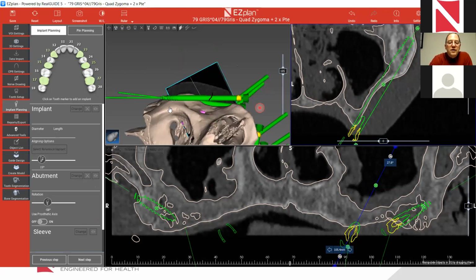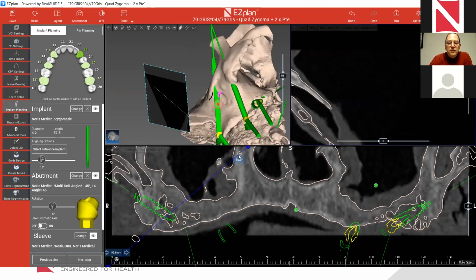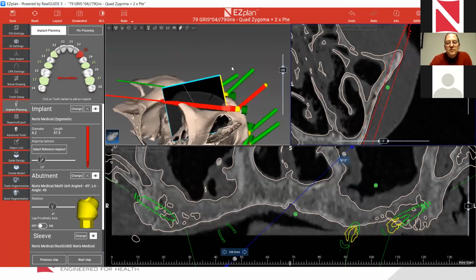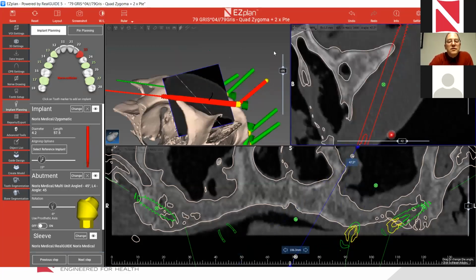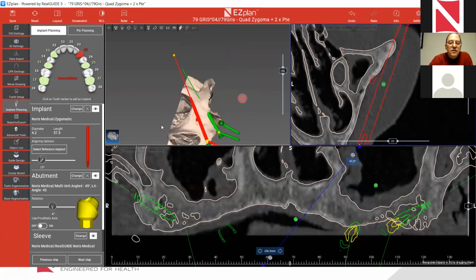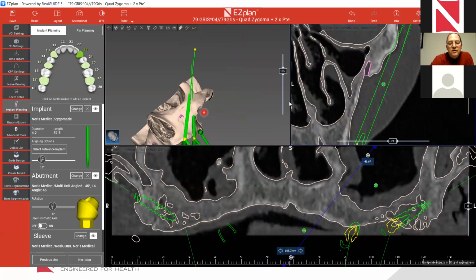If we come to put an anterior implant right now, let's say we want to put this implant right now, we need to make sure that this implant will not be colliding with the posterior implant. Okay, so let's say we come to this position like that. We put the implant. We want to put the implant on this trajectory like that. Okay, we want to put it as far from the orbit as possible, because now we have an orbit here, and we want to put it here.